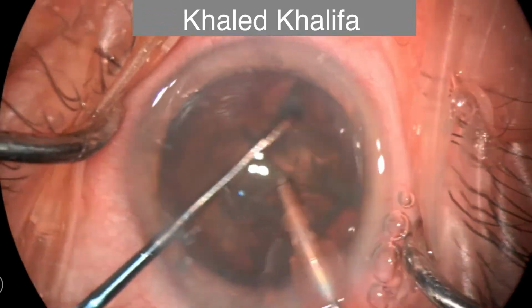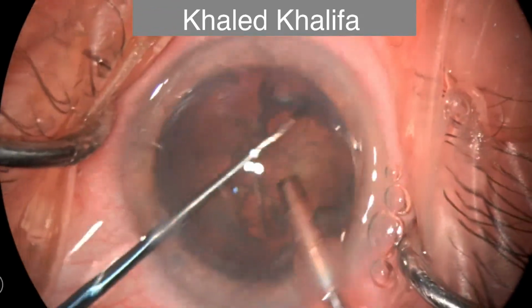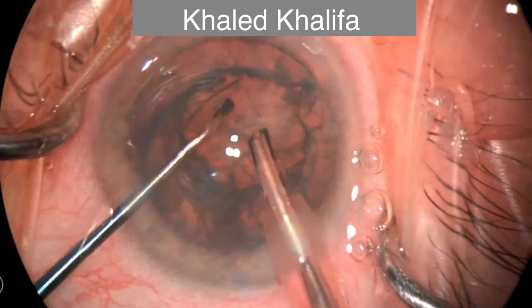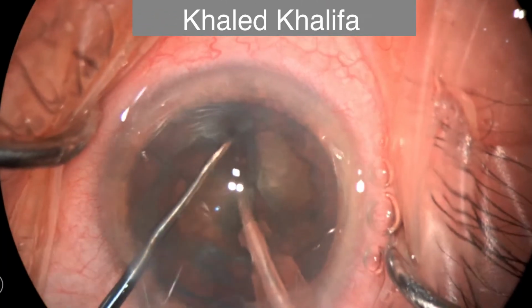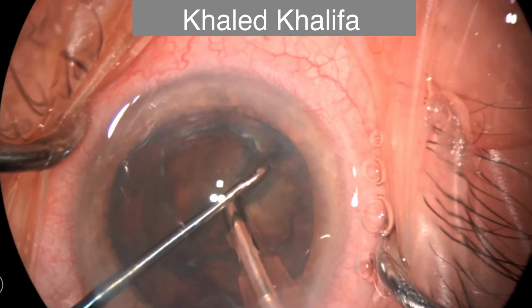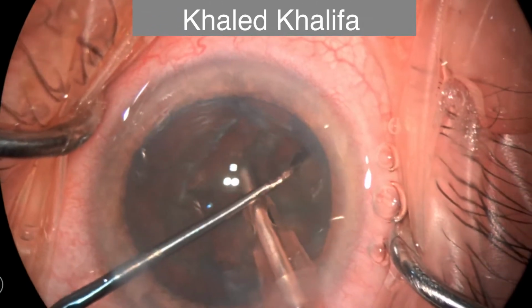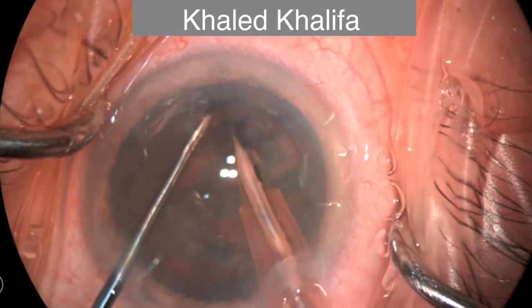Then there is some fluctuation as well in the anterior chamber because of the saline, because I think some positive pressure. Here I'm starting my chop. Yes, it succeeded to do the first chop. I'm showing now the eye, showing now the cataract, sorry.